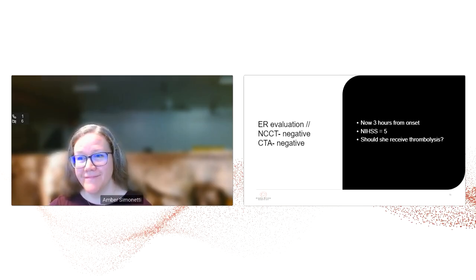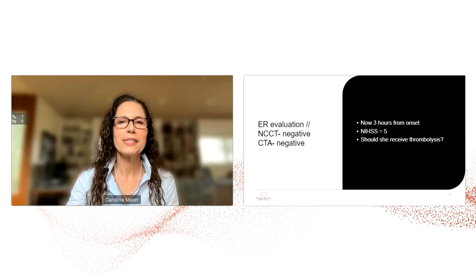That's great. Thank you. Appreciate that feedback. So let's see what's actually happening with this patient, right?